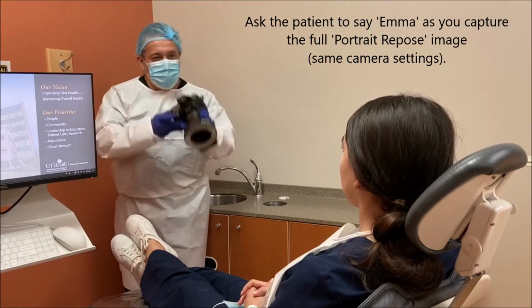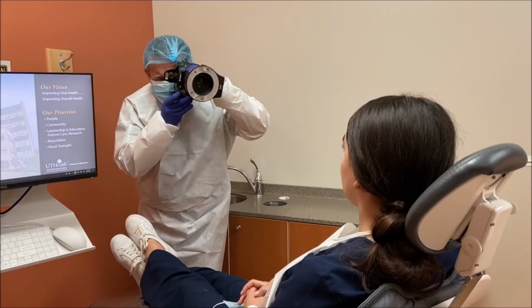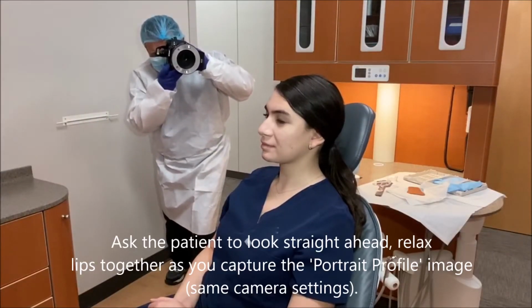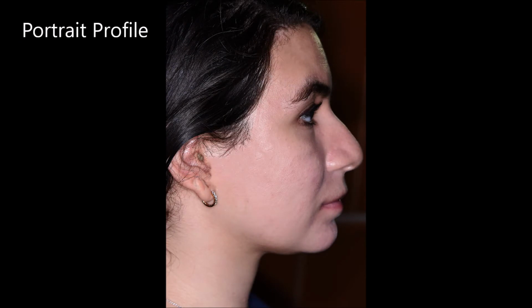Ask the patient to say Emma as you capture the full portrait repose image, same camera settings. Portrait repose. Ask the patient to look straight ahead, relax lips together as you capture the portrait profile image, same camera settings. Portrait profile.